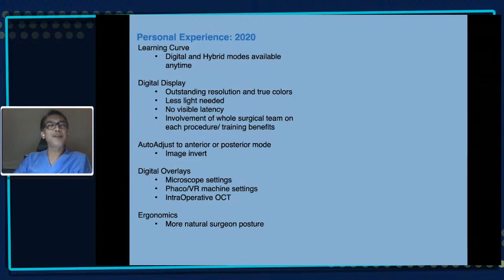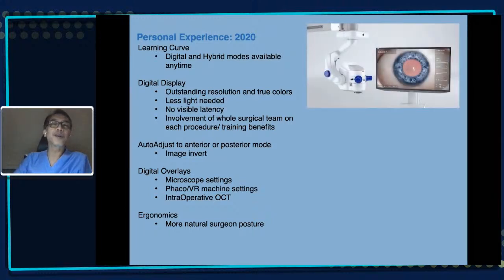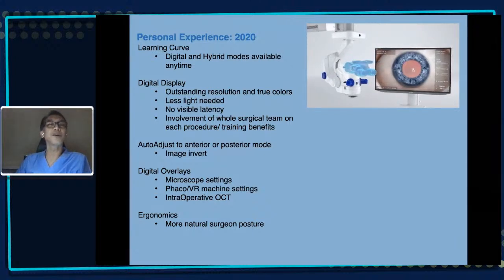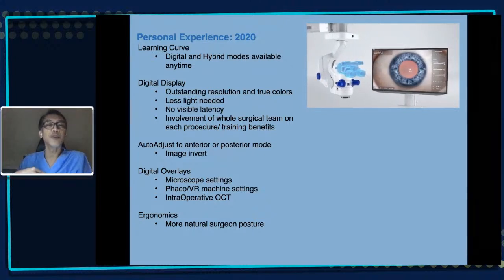Personal experience. I don't want to compare with the first 3D machine that I used, but I can't help it. Okay. Learning curve. As I told you a few minutes ago, my hesitation was that if I got into problems, it would take time before I could shift and go back to the oculars. With ZEISS, you can actually do the surgery with the oculars on. You can use the 3D, and then if you feel like going back into the oculars, you just use the oculars and everybody can still continue watching the 3D on the monitor.